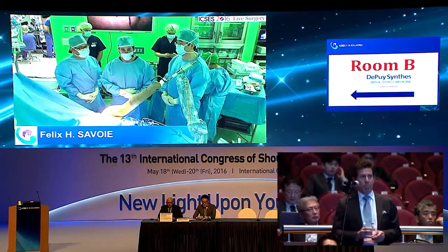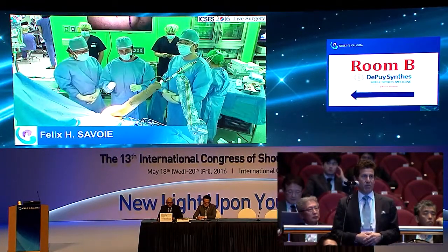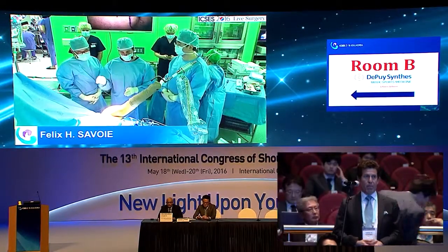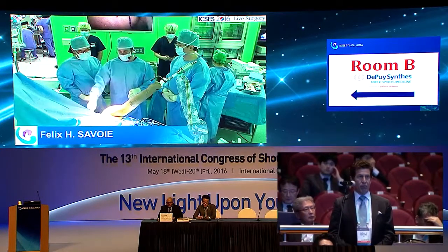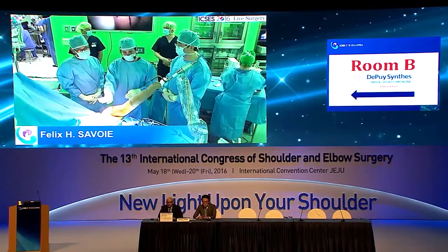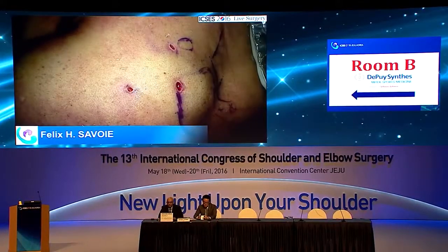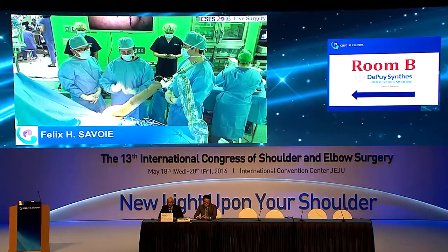Yeah, I like to oblique them. And for me, the question is always, where's my medial anchor fit best? If my medial anchor is at the 50-yard line, right in the center, then I'll suture all around it. And then my lateral anchor will need to be more anterior, closer to the bicipital groove, so I can turn it down to the front. Rarely do I go straight in line, because I like to oblique them a little bit. Plus, I add the trephination holes, like I showed you, so we could get better blood flow into the cuff, or better stem cells into the cuff.